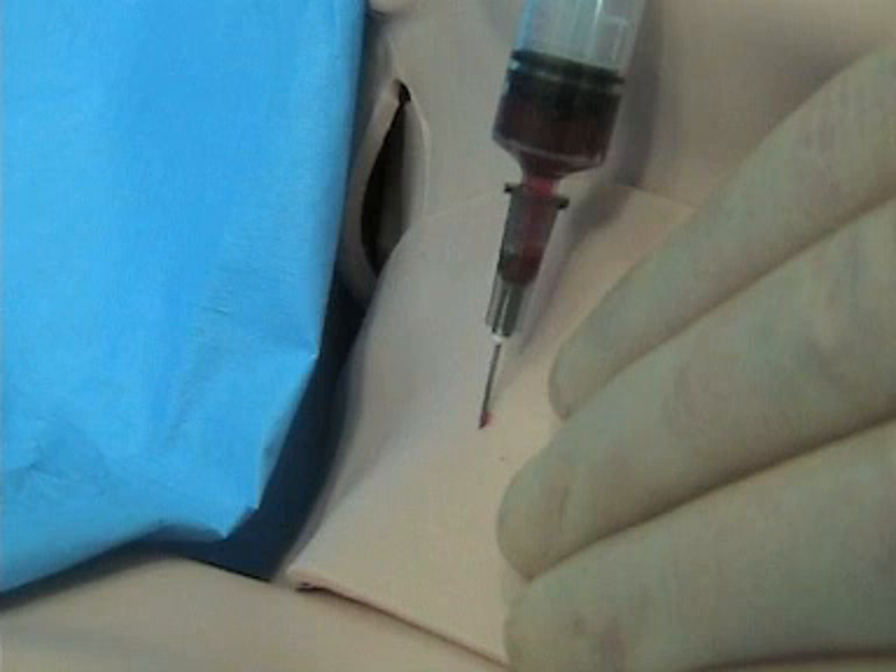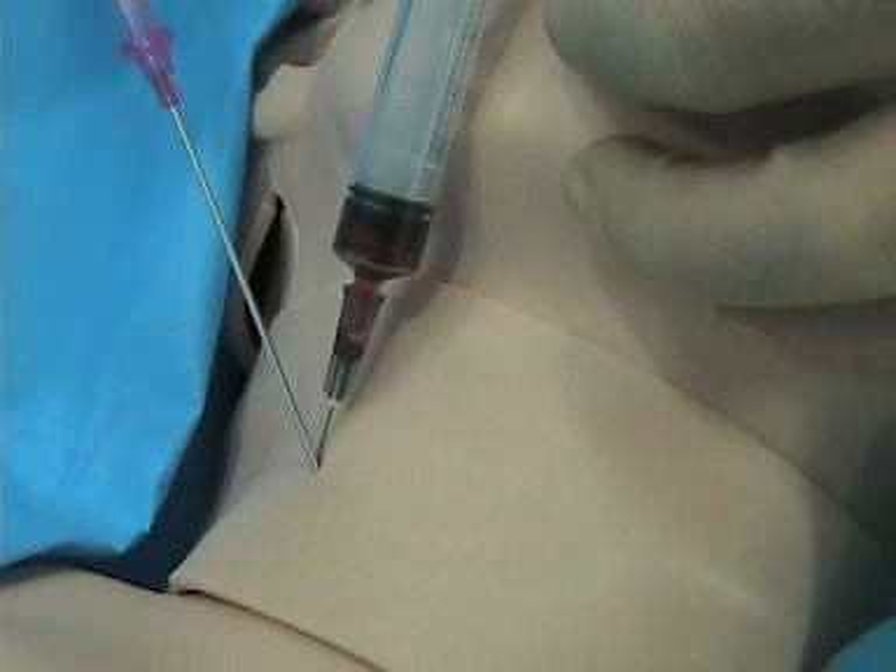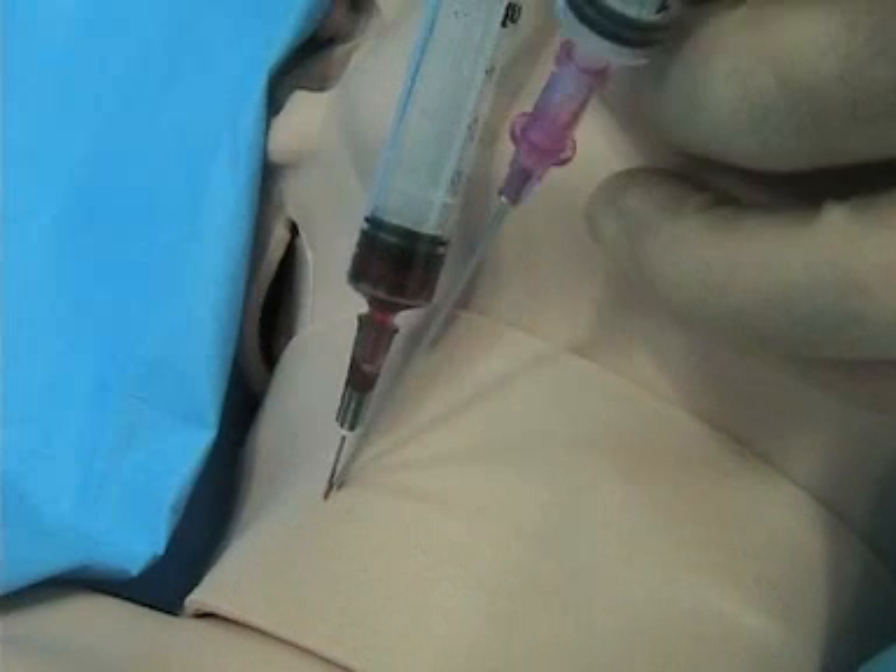Once you see that you have some blood, then you go with the other needle — some people use a catheter, some use a hollow needle at this point, either one's fine. You want to follow with the second needle at the exact same angle as the finder needle, so that you're going to head in the same direction and find the vessel. If it's turned off at an angle, you're going to miss. So make sure you lay it right along where the finder needle is.